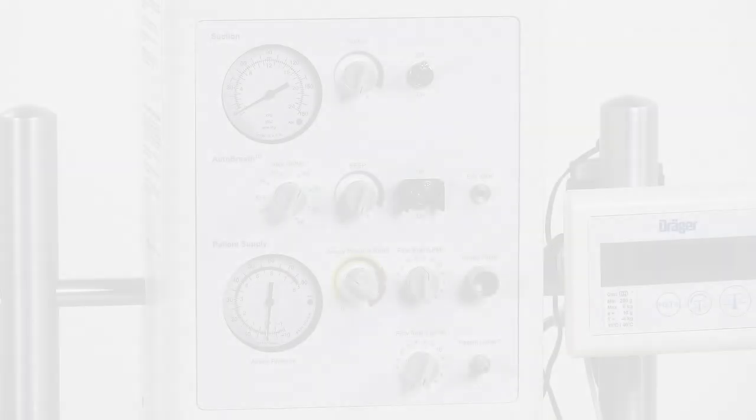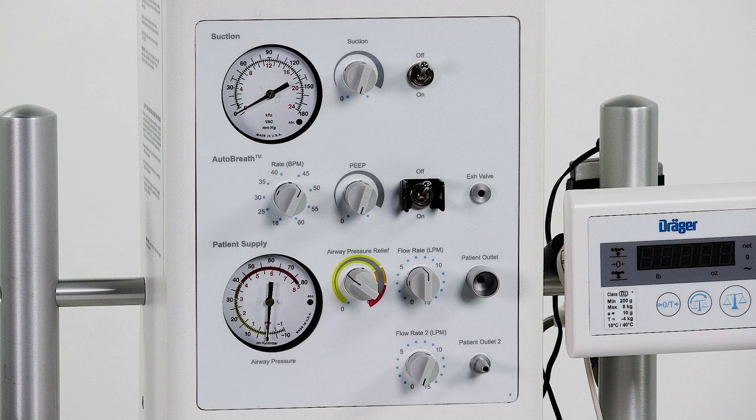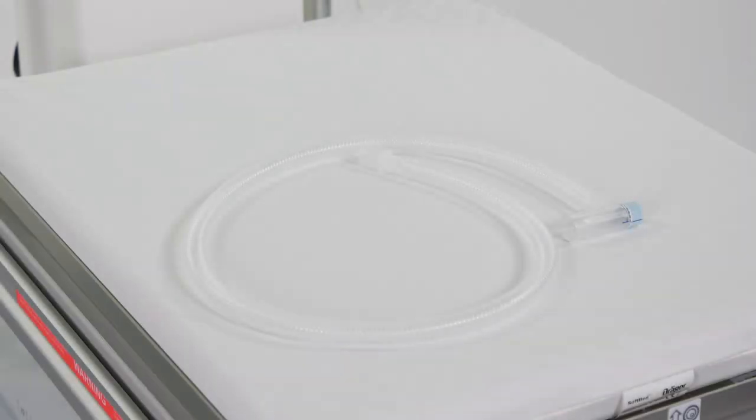There are a variety of resuscitation modules that can be offered depending on the country and the options. There is an airway gauge, airway pressure relief knob, flow rate, patient outlet, patient outlet 2, and a flow rate 2. There are T-piece breathing circuits that are specific to the external pressure versus internal pressure and are delivered accordingly.